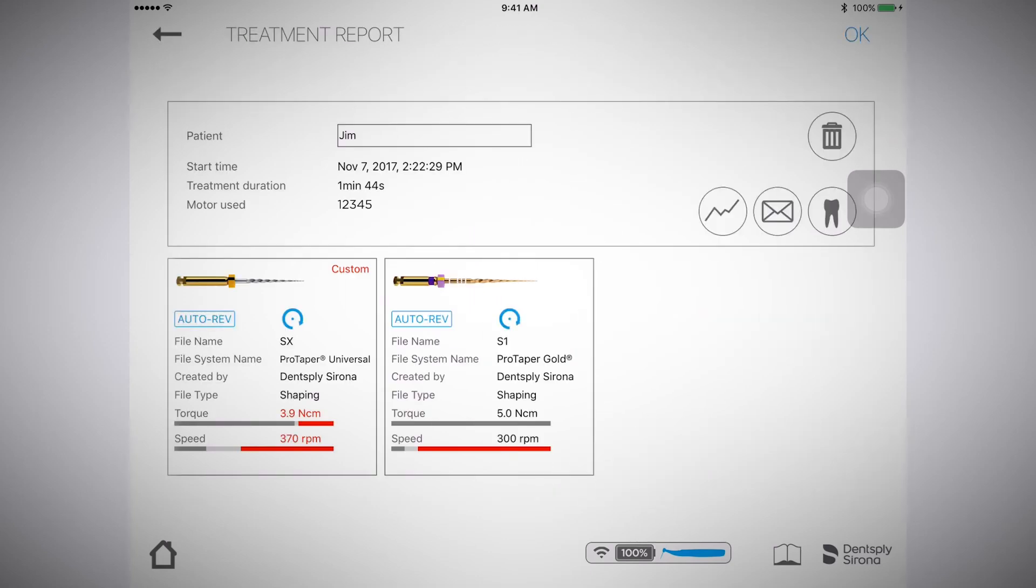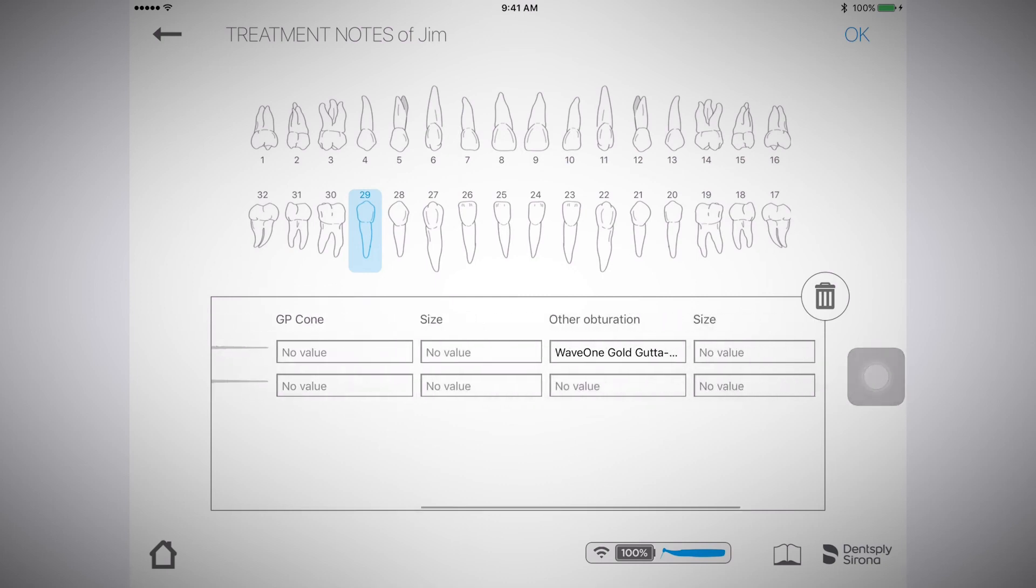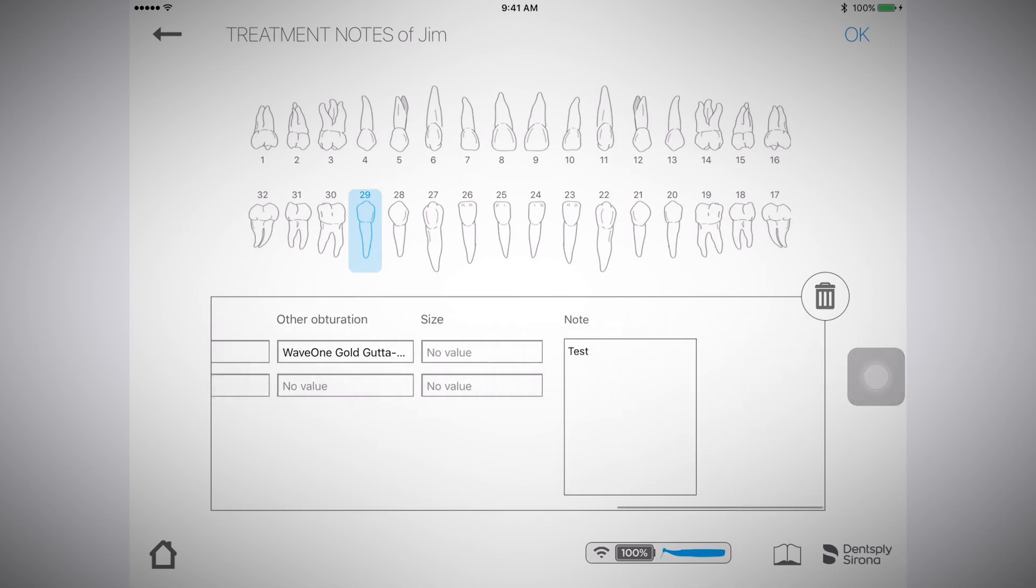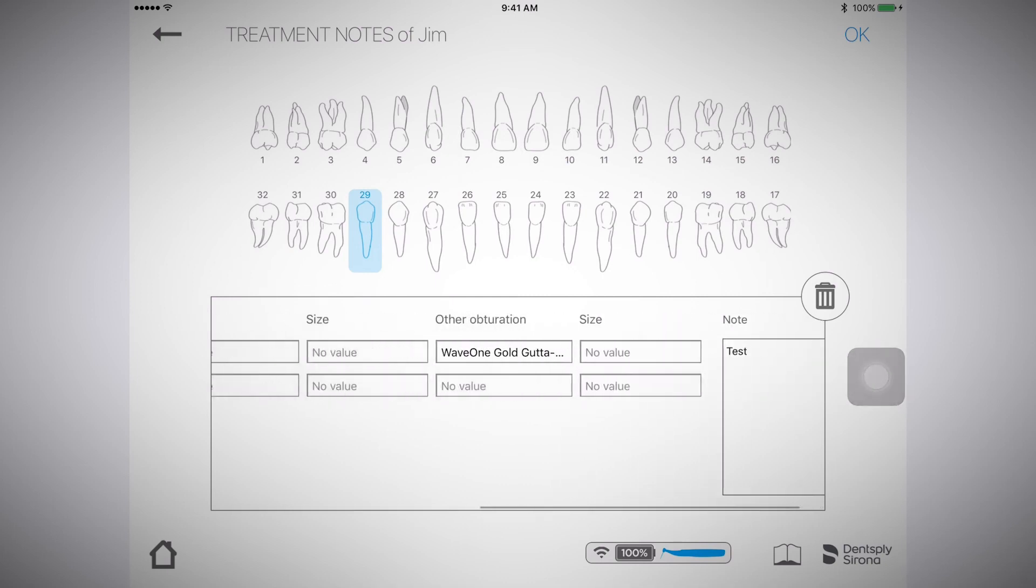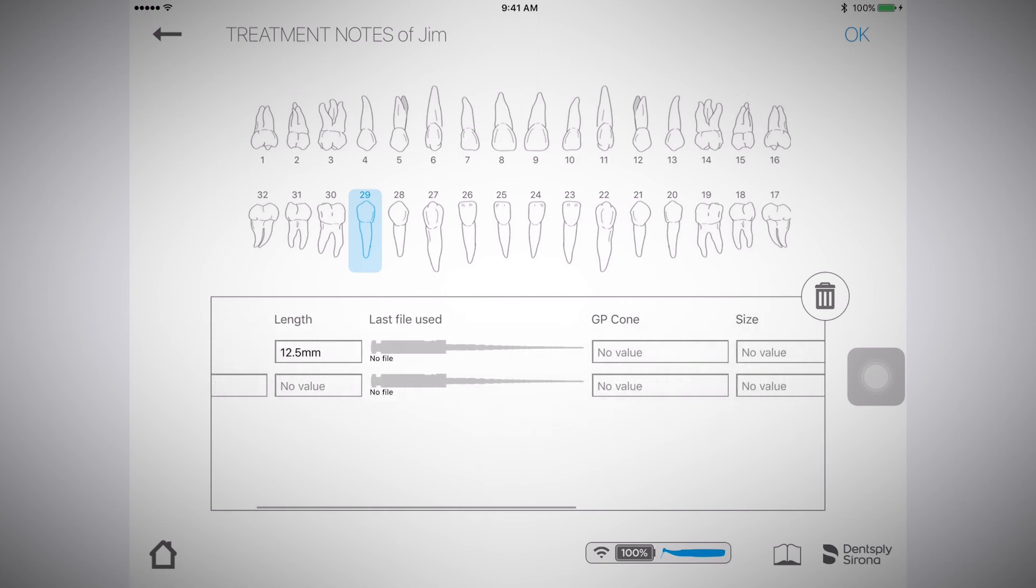You'll also have the ability at this time to add information to the treatment notes. To do that, select the tooth icon, select the tooth worked on, and enter your information you would like to include in the treatment report.